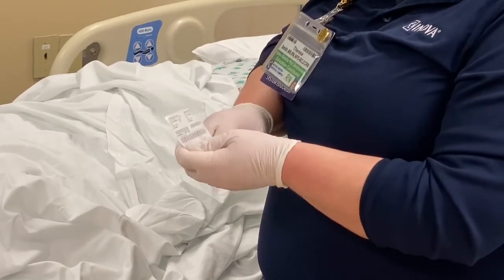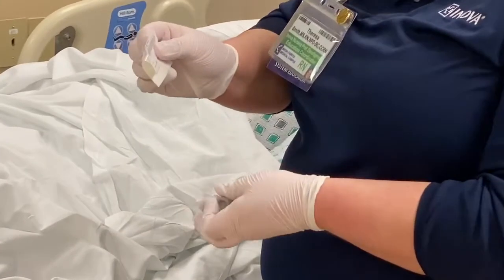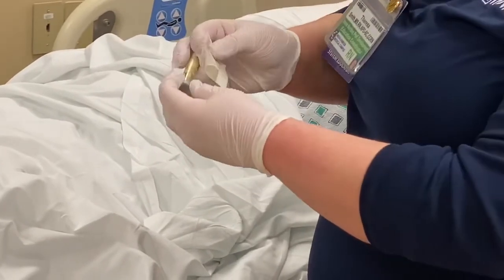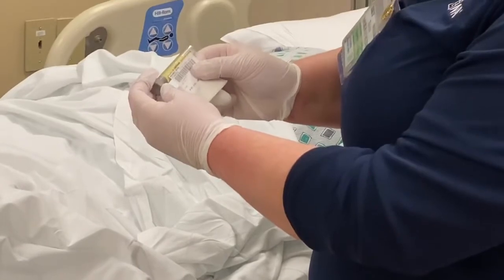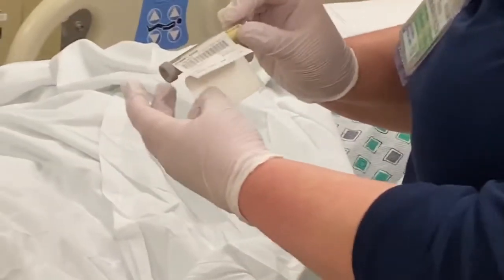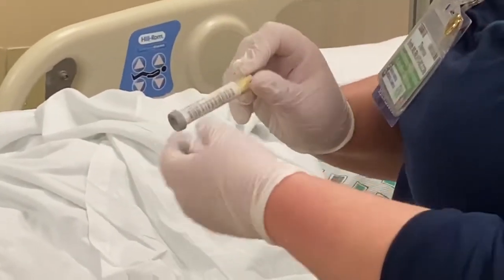So what I like to do is peel back these 2 short labels so that my big label kind of pops up and I don't have to use my fingers to pull it off. And then I'm still going to line it up with the manufacturer's label. I'm just going to put it close to the top of the tube. And then I can pull the little labels off and I can secure my label to the tube.